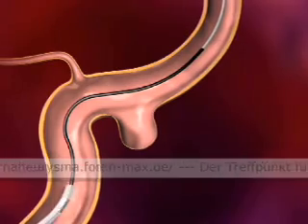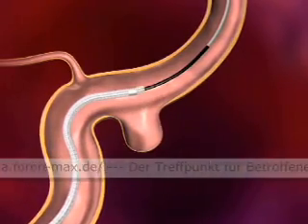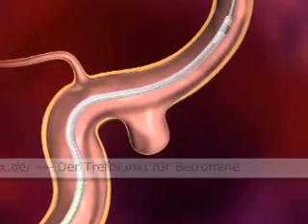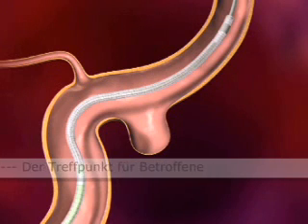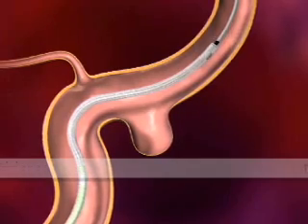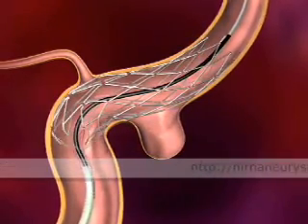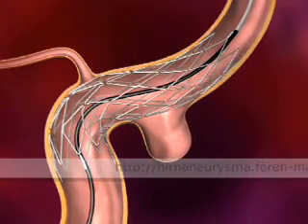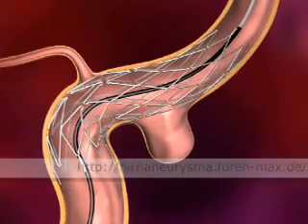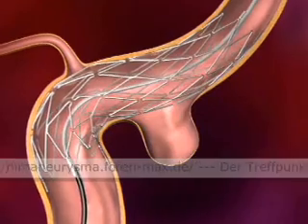Deploy stent. The system is advanced so that the undeployed stent passes the aneurysm neck. The two-French stabilizer catheter engages the stent, maintaining its position and allowing the stent to be unsheathed from the three-French micro-delivery catheter. After the stent is completely deployed, the delivery system is removed.